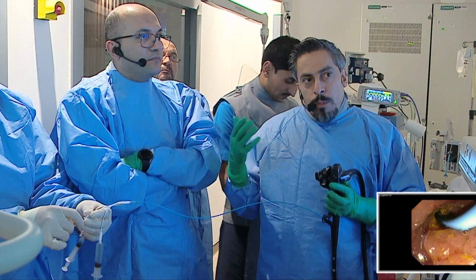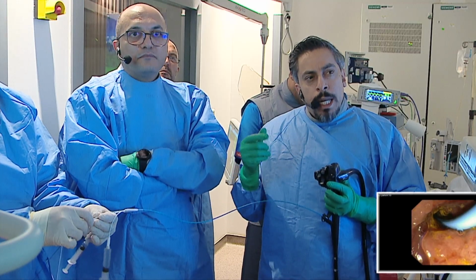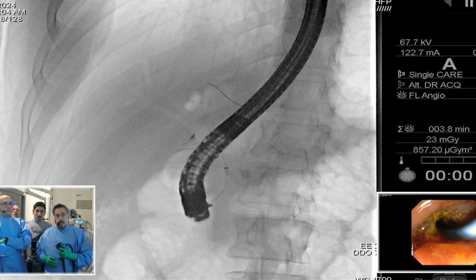We know that this patient has a stone in the duct. So I agree. That description you mentioned, Dr. Bishar, is exactly the benign stricture. It's not a stricture, it's more like a tapering. And even the spyglass that you showed, right.